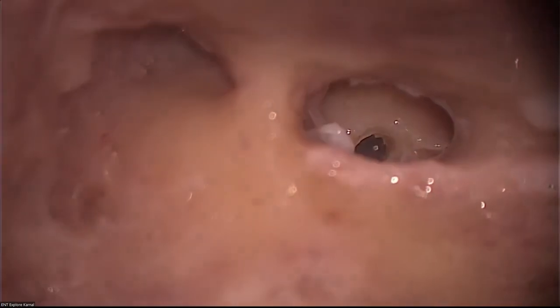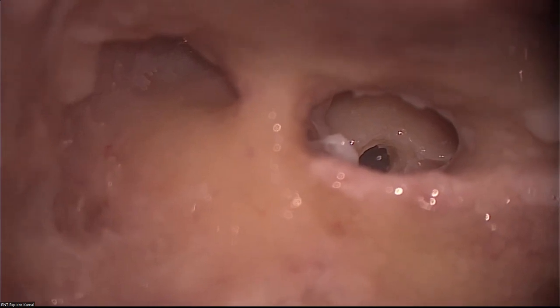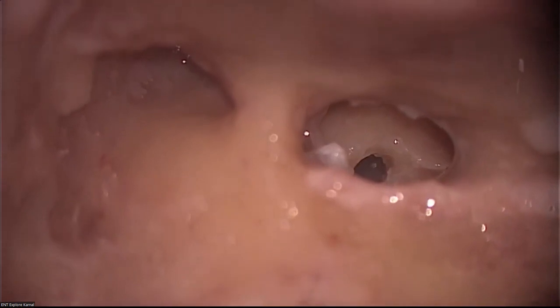Now see the depth of the scala tympani. We can see the straight shot. Now when I push my implant, it is going to go straight in the lumen. Let me show. It is going to go straight in the lumen. See that? Now I turn my view and see this. This implant is going to go straight in the lumen. Can you see?